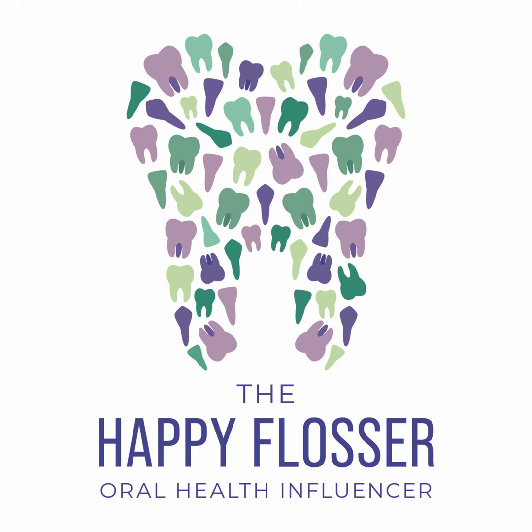Having the patient in the right position helps you with your ergonomics and the ability to get the tray where you need to get it, but it also helps the patient to reduce their gag reflex, to calm their nerves and get their anxiety under control if they are a patient who has those issues and concerns. So keeping the patient upright with their head tilted slightly forward, and maybe even down a little bit after you put the impression tray in, goes a long way at helping you.